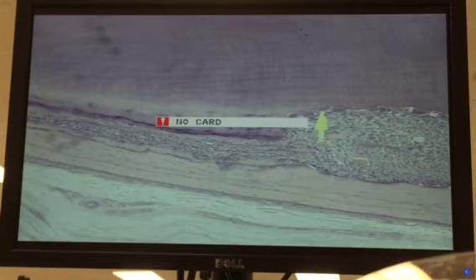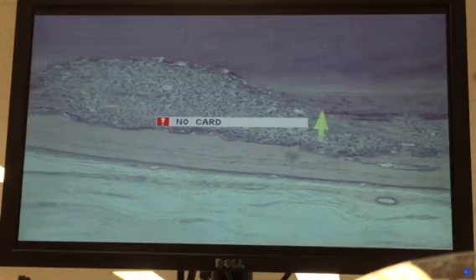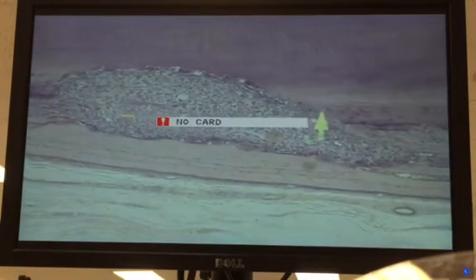Well, it looks like one, but since it's eroding dentin, it would be what? An odontoclast. It probably is an osteoclast, but since it's eroding dentin, it is an odontoclast. And if it were eroding the cementum, it'd be a cementoclast. In fact, we have probably, well, maybe one right there.